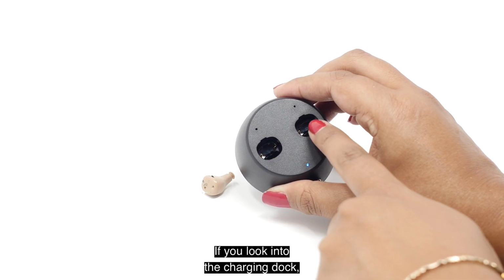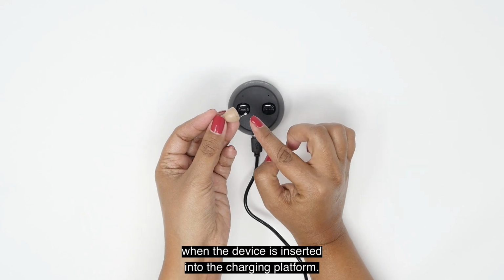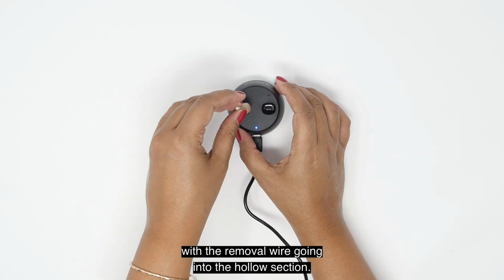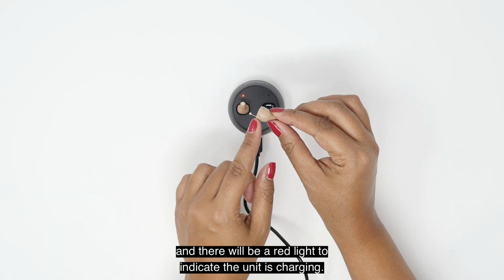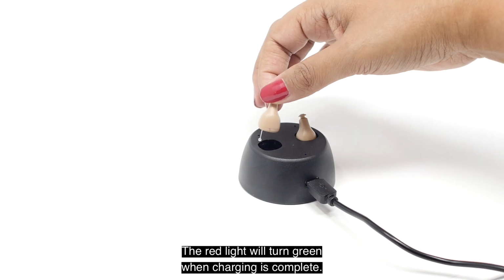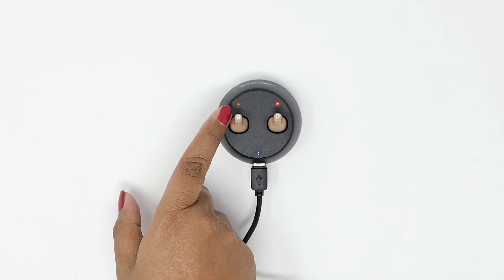If you look into the charging dock, you will see a hollow section where the removal wire will go when the device is inserted into the charging platform. Lower the device into the charging dock with the removal wire going into the hollow section. The device will magnetically click into place, and there will be a red light to indicate the unit is charging. The red light will turn green when charging is complete. It should take between 4 to 6 hours for the unit to fully charge.